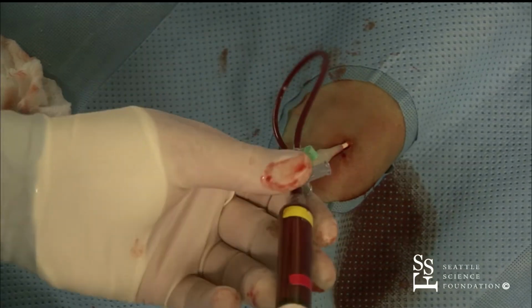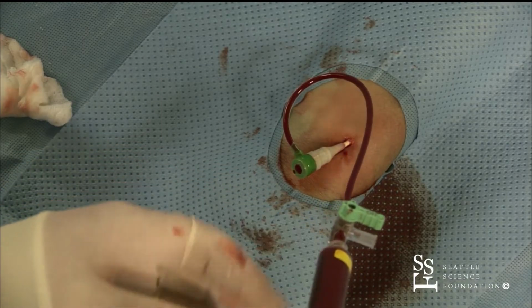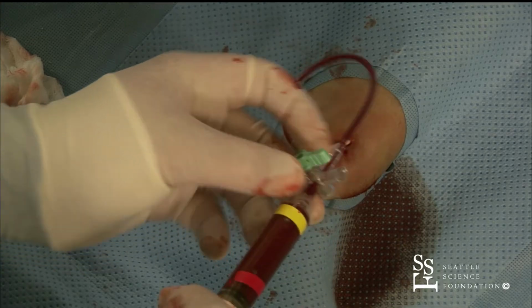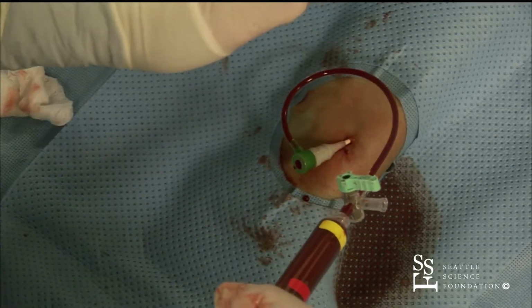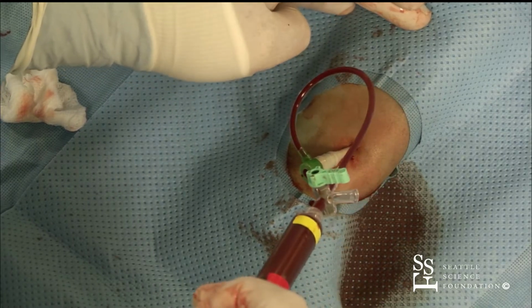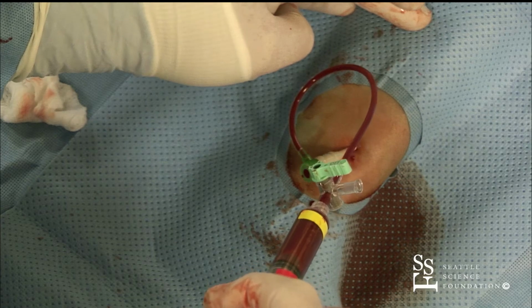Okay, so this is a little bit of verapamil here. It's 2.5 milligrams of verapamil in the syringe, and we're going to dilute it with blood, because the pH of the verapamil tends to be very irritating when you inject it. I usually tell the folks, your arm's going to feel a little warm here, and it'll pass in a moment. Okay. One thing about the Slender sheath is the color coding. You know that all the 5 French sheaths are gray.